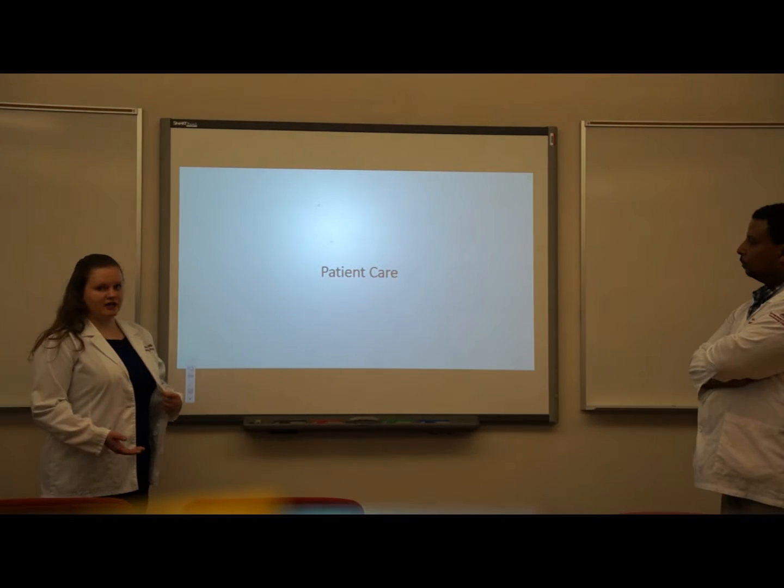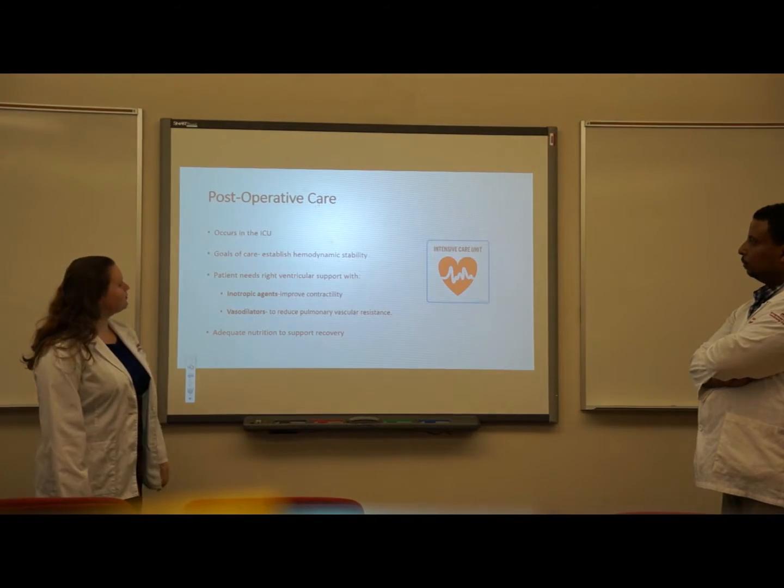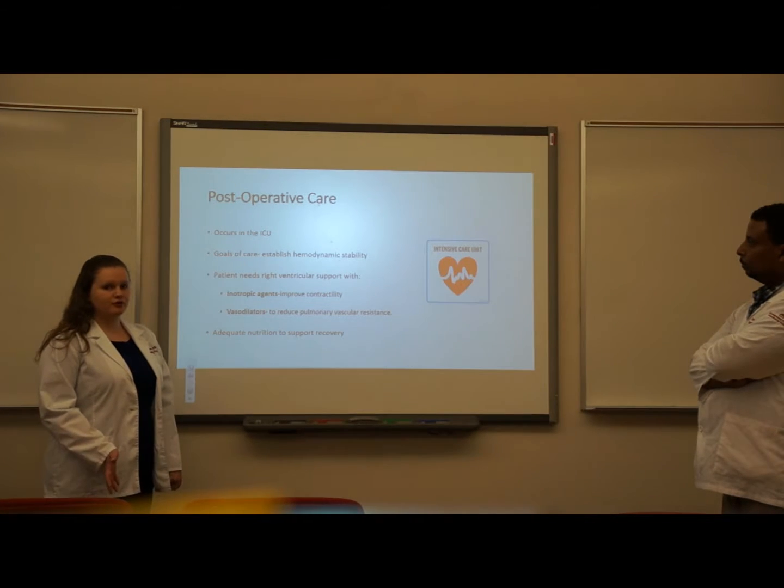Now we'll talk about patient care of a patient with an LVAD. Post-operatively, they will be immediately transferred to an ICU.